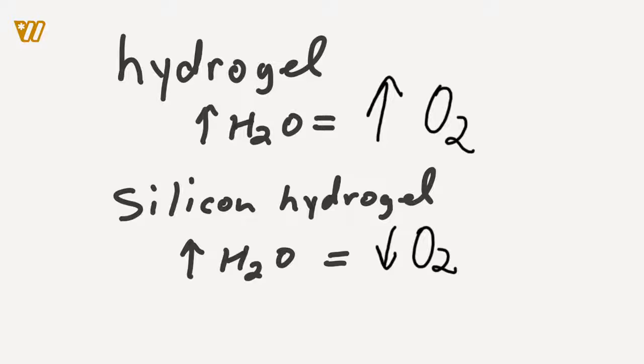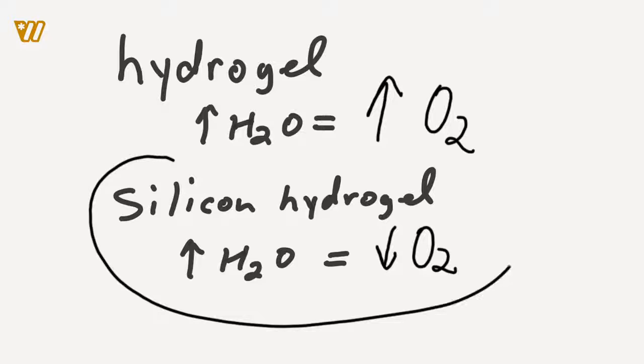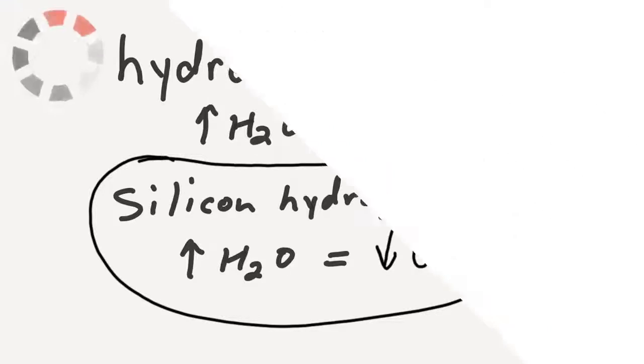So you're going to lower your permeability of oxygen to your cornea. So you're going to actually lower the Dk of that contact. Now, is that something we think about clinically? Not always, because silicone hydrogels, even ones that have a higher water content, are still going to have a Dk of 90 plus. So we're still going to get a lot of oxygen to the cornea, but technically that is a true statement, right? If we increase water content of silicone hydrogel, it's going to decrease oxygen permeability to the cornea.